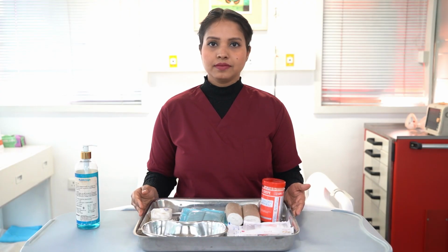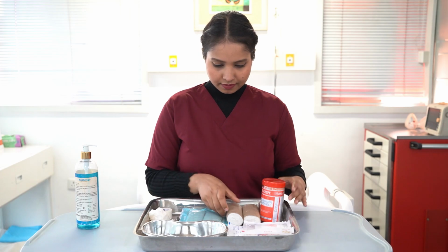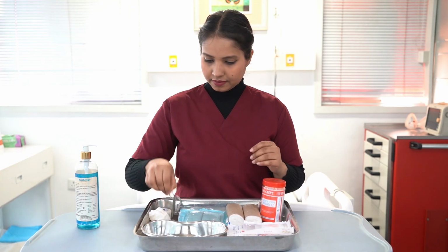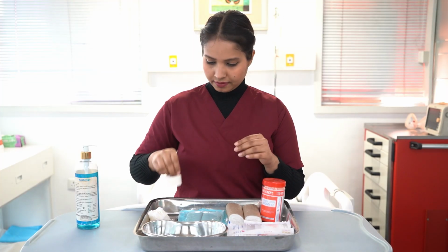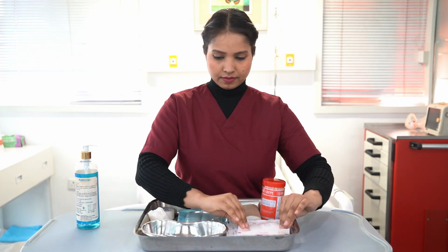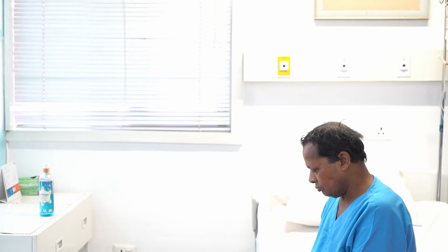Equipment required: a tray containing loose gloves, appropriate bandages, scissors, adhesive tape, dressing material like gauze, and a kidney tray. Recurrent bandaging.